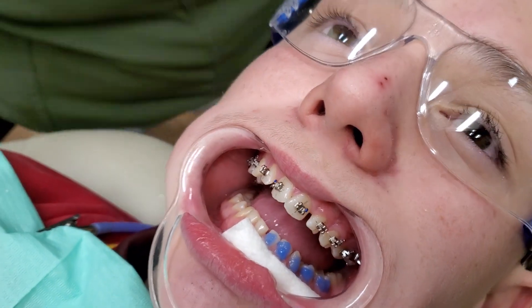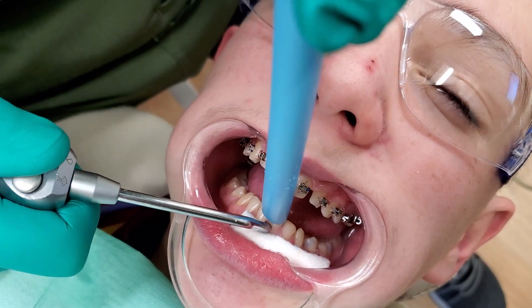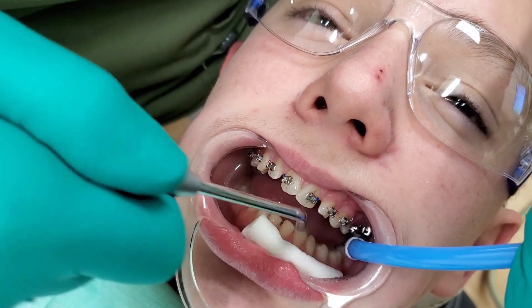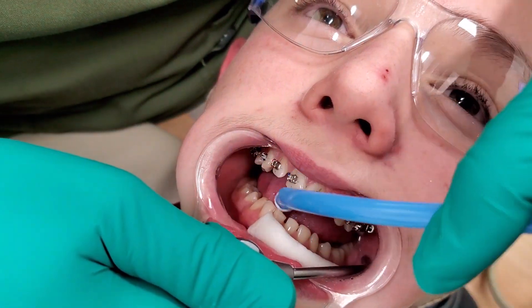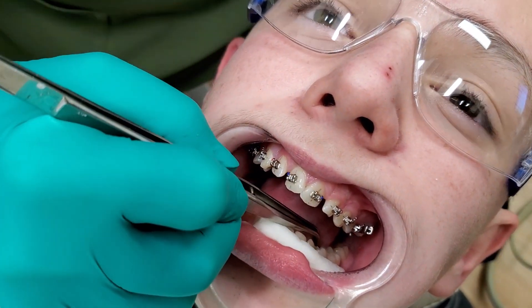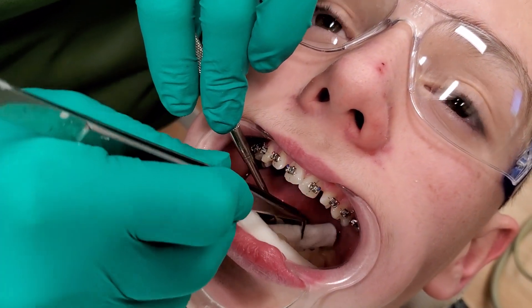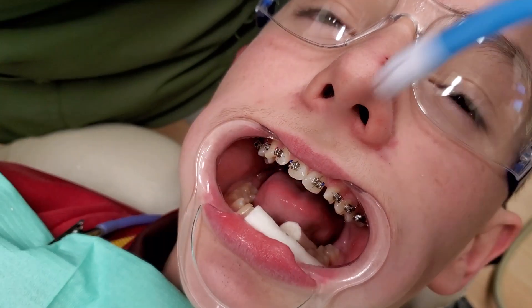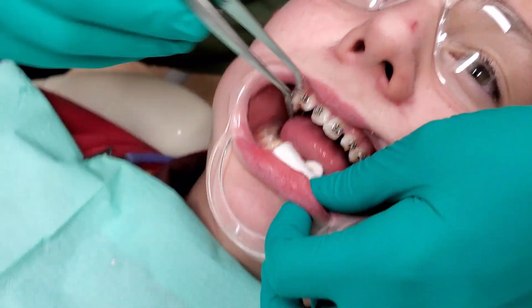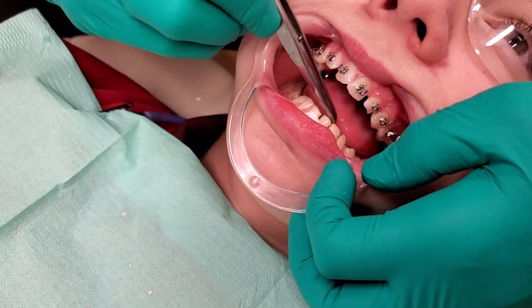I'll switch to my high volume to get the bulk of it off of there, and then I'll switch back to my saliva ejector. I tend to switch this guy last because that lip will curl back in — I'm always worried I'm going to get saliva back on the front ones.